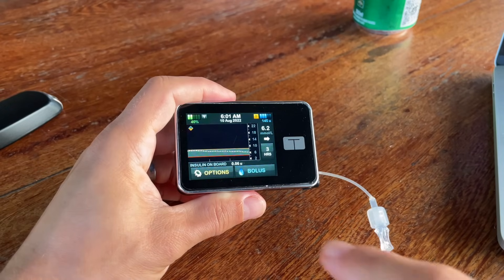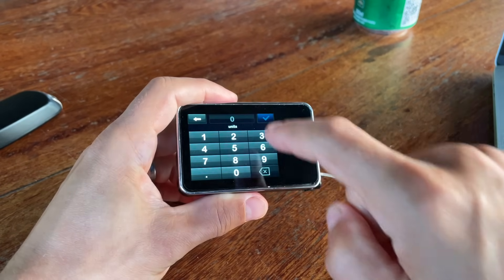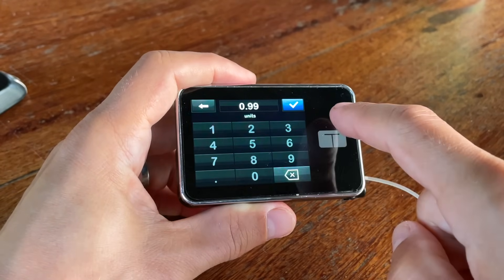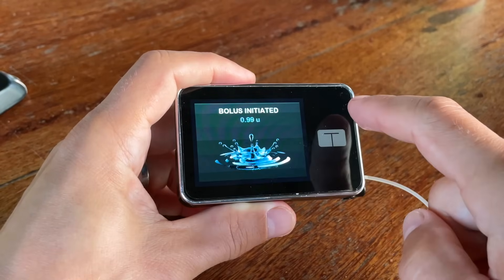What I personally find super helpful is that the pump shows you how much insulin on board you still have — that's the insulin you injected within the last few hours that's still active. The pump also has extremely precise insulin dosing: you can tell it the exact amount you want with precision to 0.01 unit, so you can inject 0.99 units if you want.